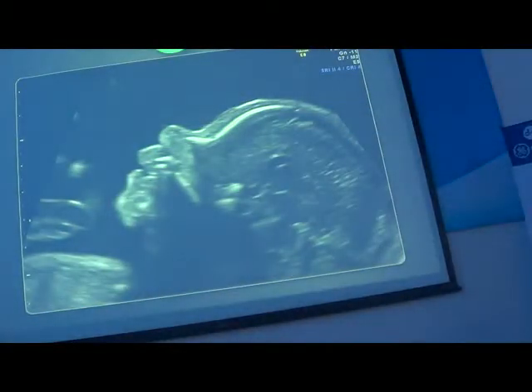Now we move to the second and the third trimester scan, the examination of the face. The main difference between 22 and 32 weeks is that at 22 the examination of the face is easy to do because we have lots of space, but at 32 it's more difficult because sometimes the face is inside the placenta without fluid in front. Here is the face scan at 22 and 32 weeks. At 22 weeks it is much easier because there is a lot of amniotic fluid, while at 32 weeks there is less fluid and the placenta makes it difficult.